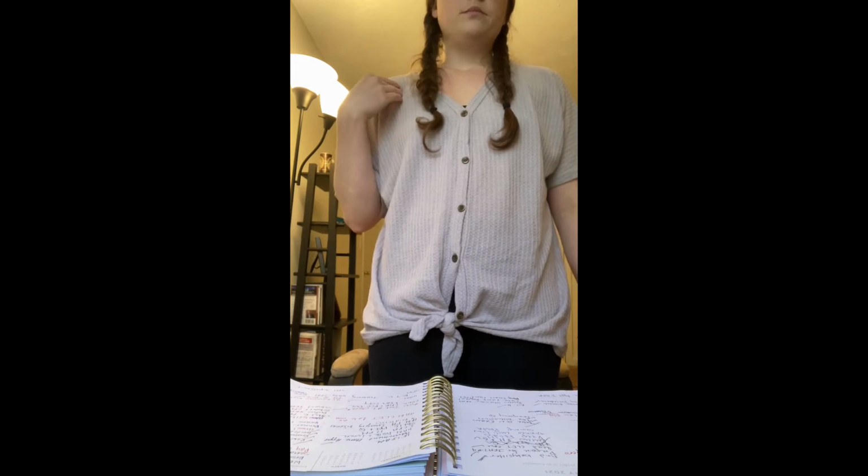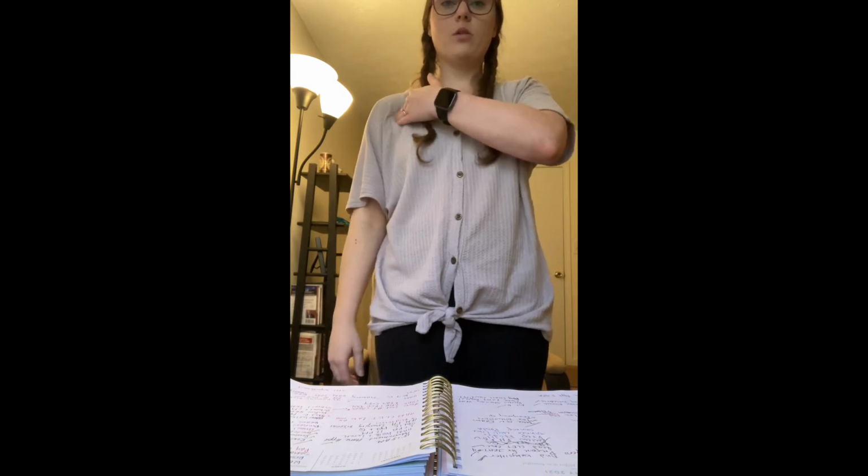And these are the chronic pain or non-trauma views that you would do. So for AP shoulder, external rotation, I would have the patient standing in the center, but we're going to make sure that the central ray is going through the coracoid process. We're going to ask them to supinate their forearm, and we're going to make sure that the arm is a little bit abducted as well.